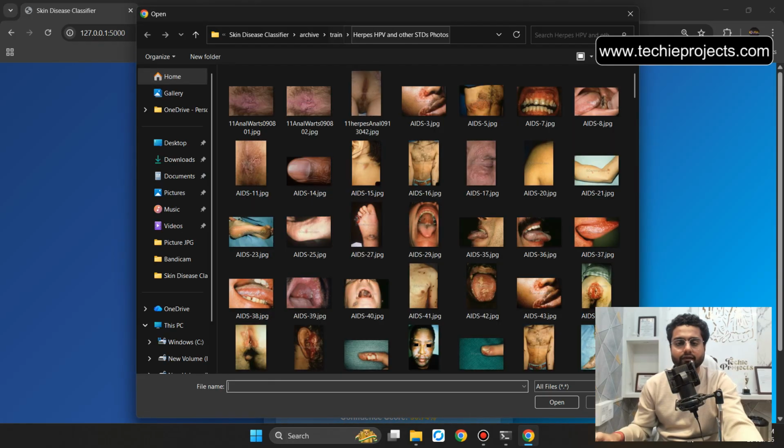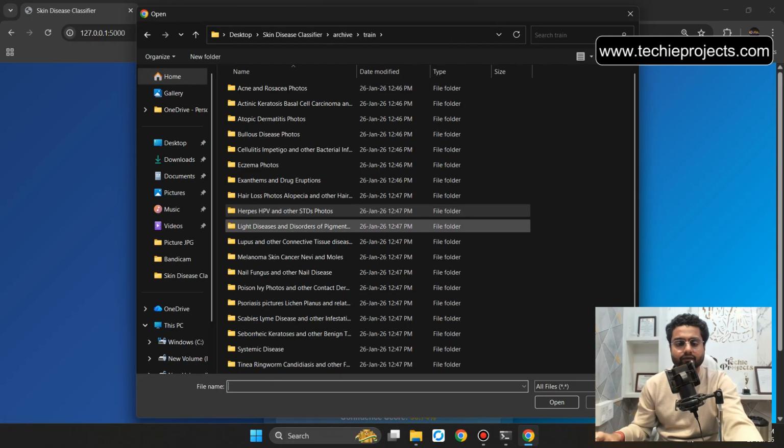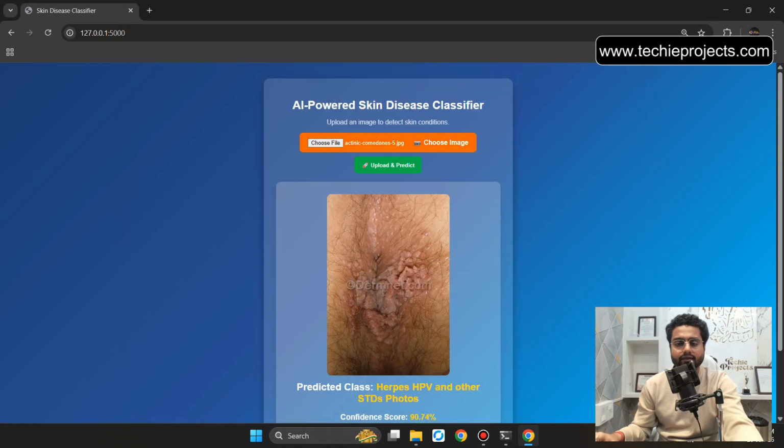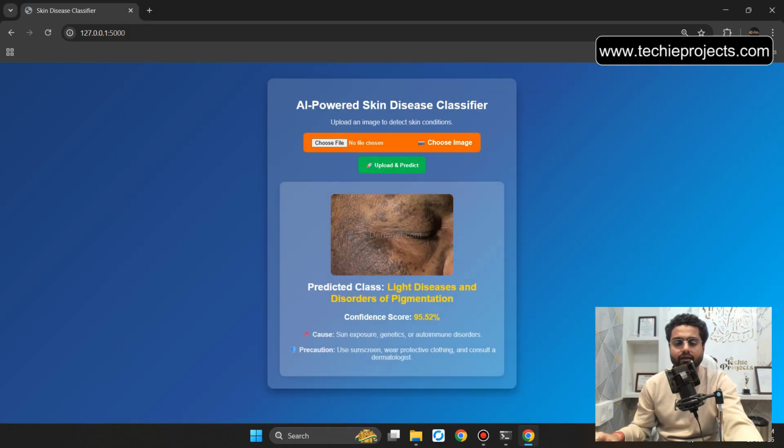Let's choose any other file from a different folder. Let's select this folder and select this image. Then click on upload and predict. So it predicts light diseases and disorders of pigmentation. Confidence score 95.92%. Cause: sun exposure, genetics, or autoimmune disorders. Precaution: use sunscreen, wear protective clothing, and consult a dermatologist.